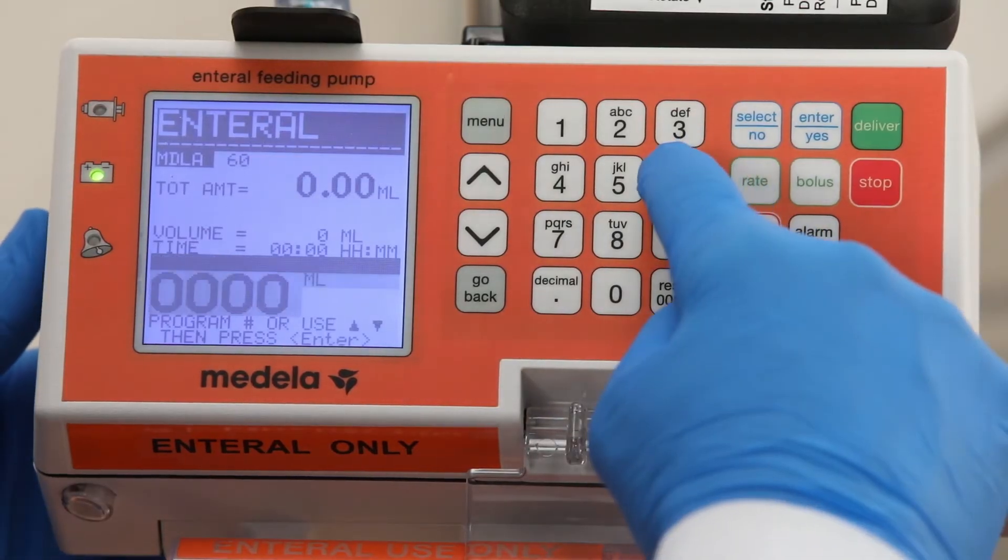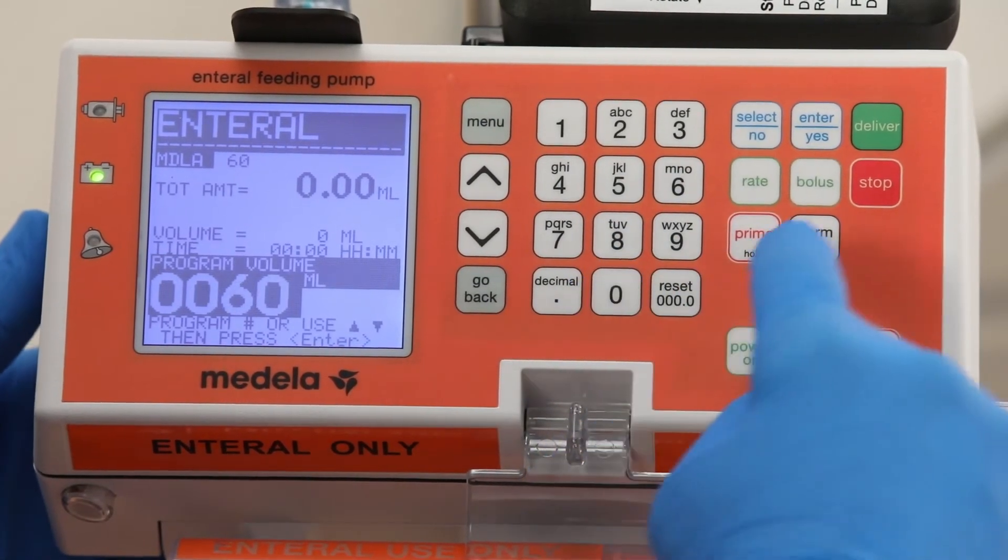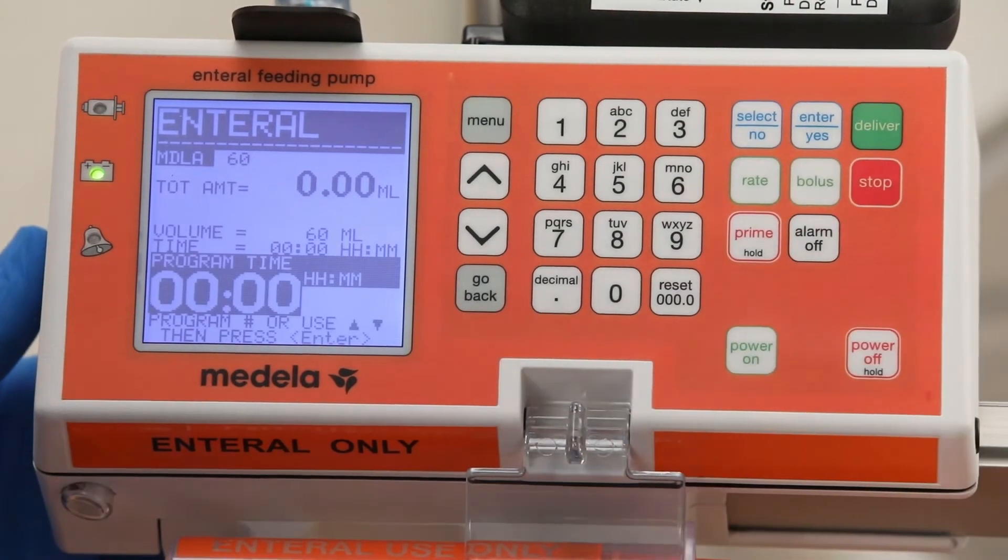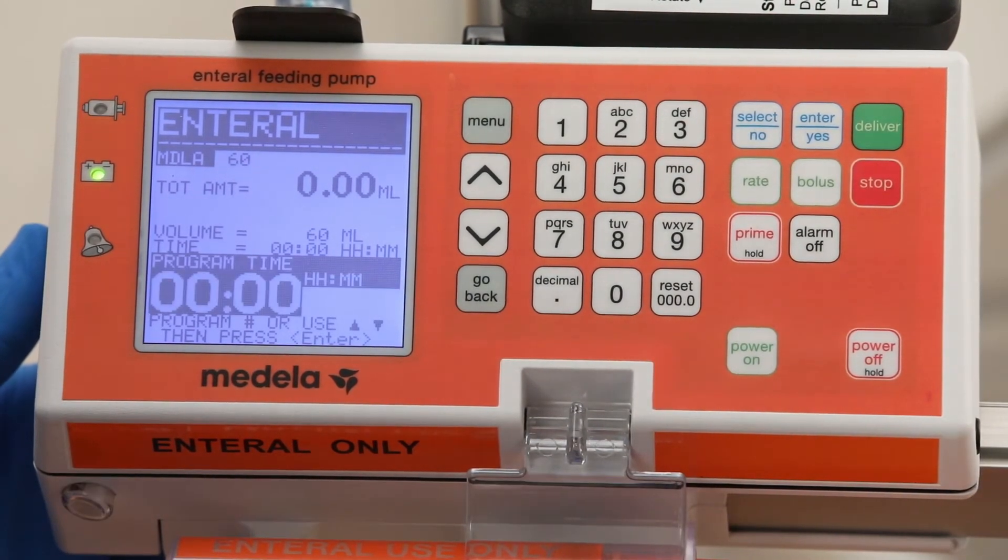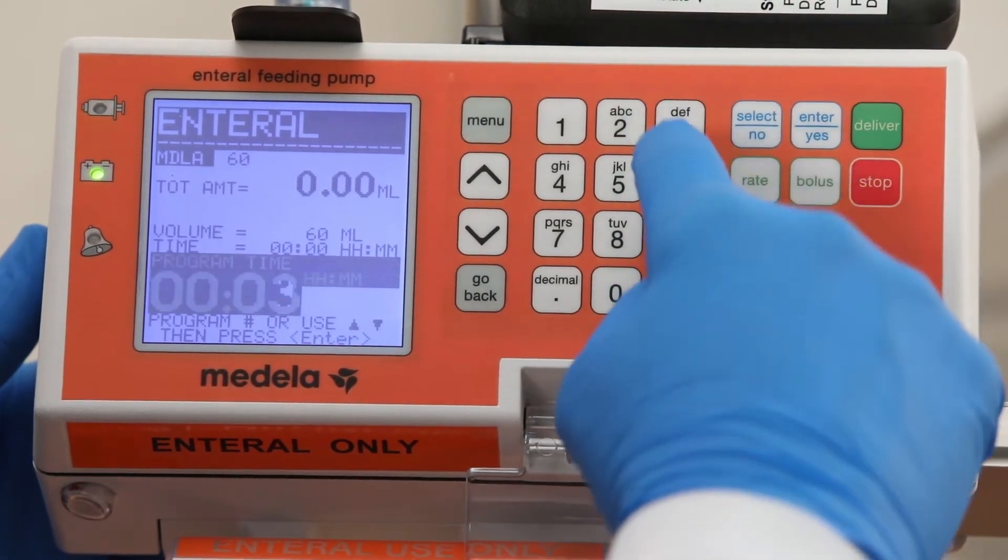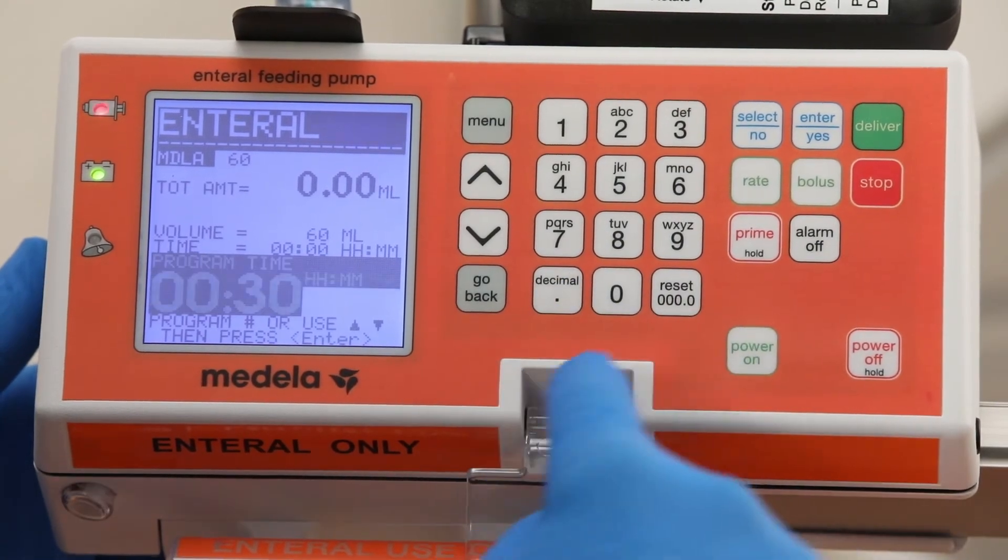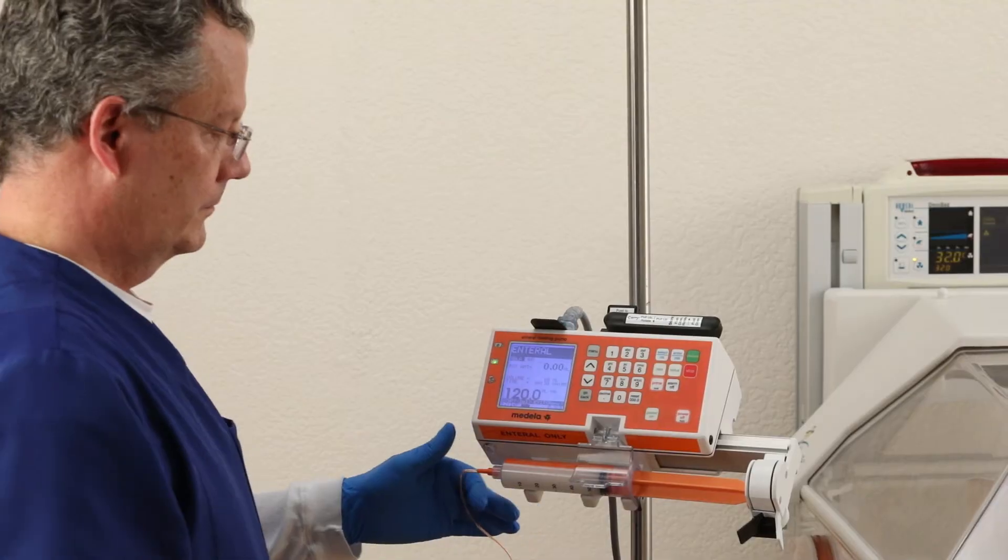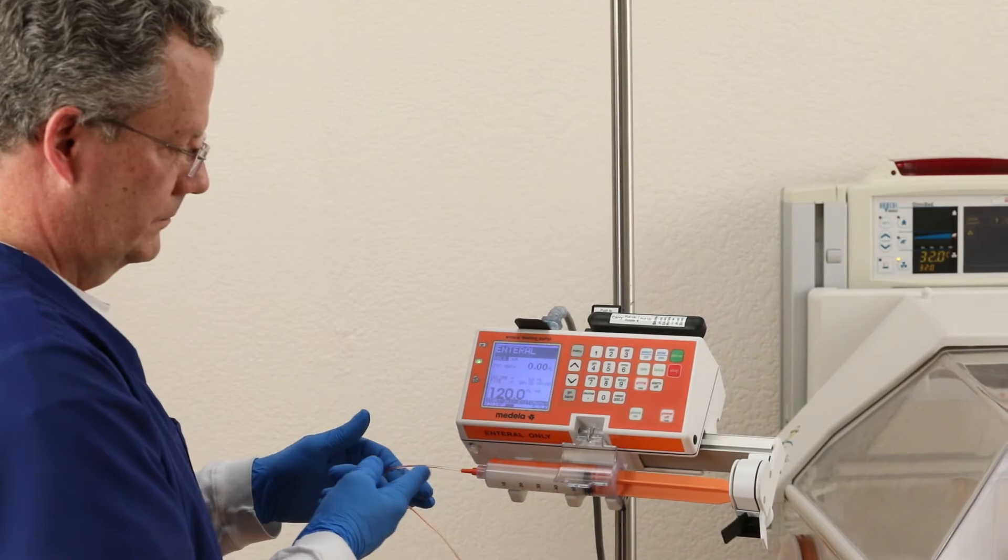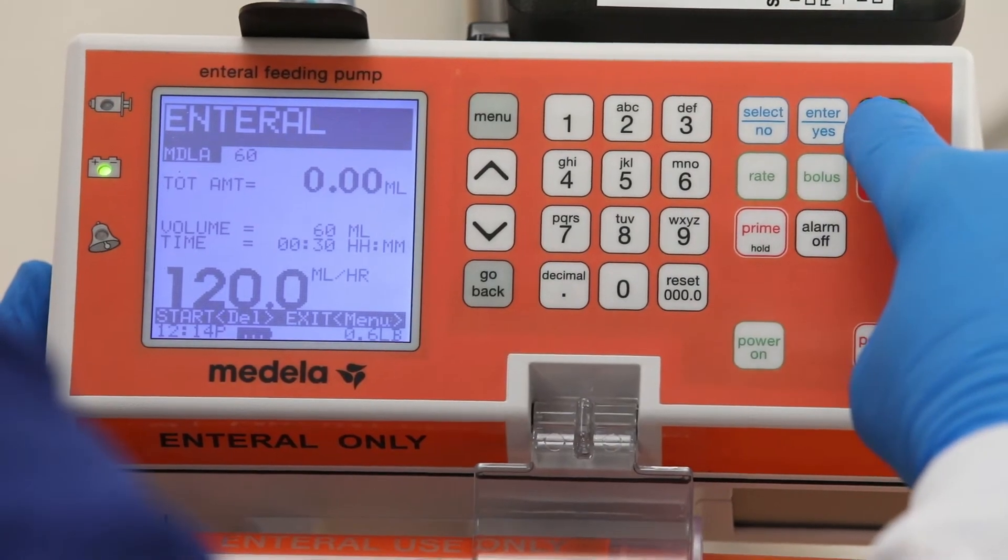Use the number keys to program the volume amount to infuse and press the enter/yes key. Use the number keys to program feed delivery time in minutes or hours in minutes and press the enter/yes key. Trace the tubing to the patient to confirm proper connection. Then press deliver to start delivery.